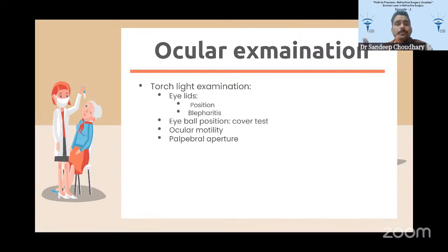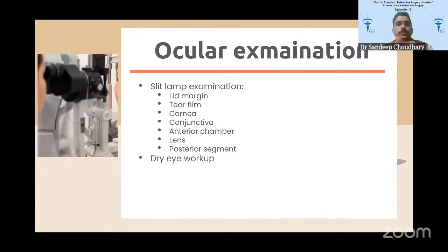Sometimes, in cases of deep set eyes, if the patient has a very deep set eye, then it becomes a problem, especially while planning some femtosecond laser procedures, because the docking becomes very difficult in very deep set eyes or narrow palpebral aperture cases. So everything is important. You need to examine the patient thoroughly.